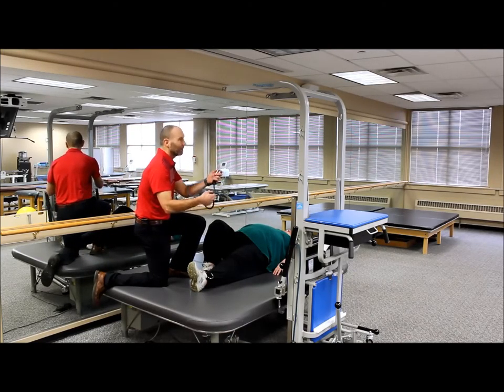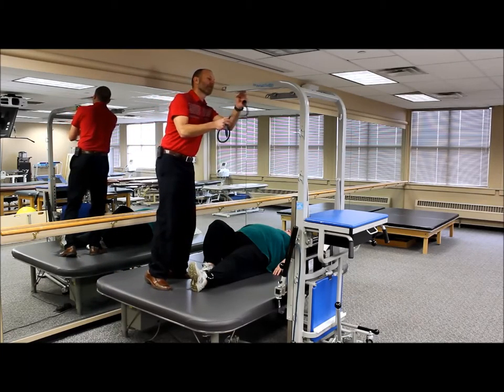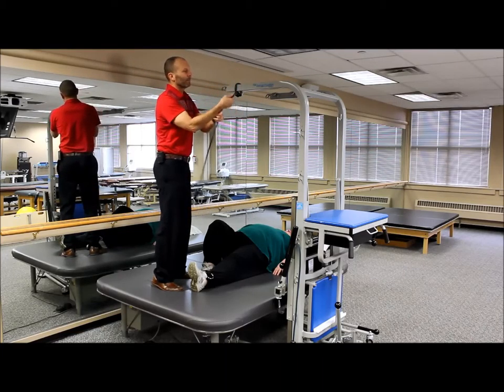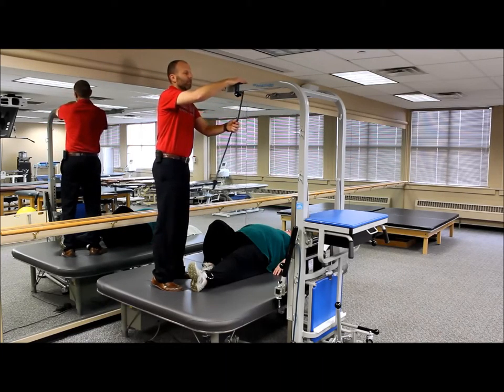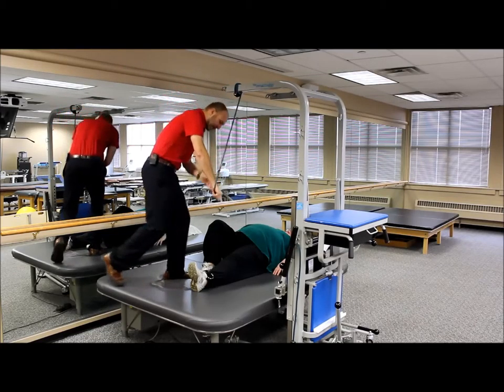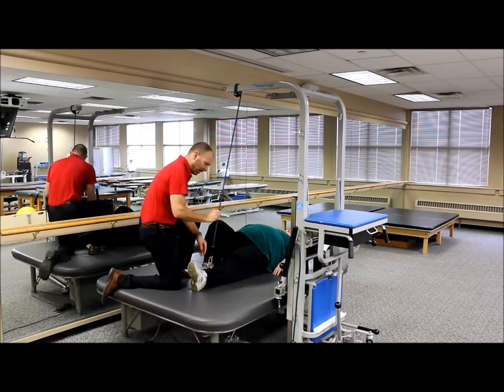What we're going to do is take one of our bungees here and clip it into our upper support structure, and we're going to do a couple of loops around the top of this, behind the support attachment so it doesn't slide off. Then we can come down and use our ankle cuff here, and now we're giving a little bit of help for this.